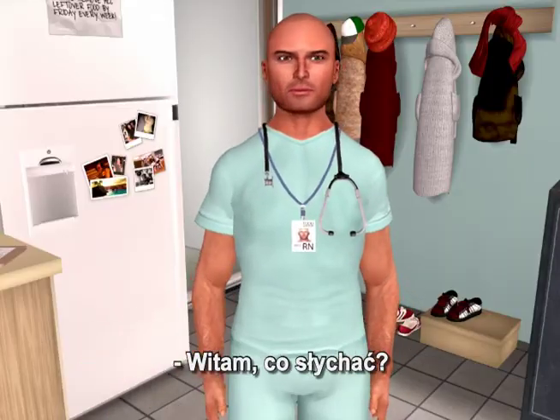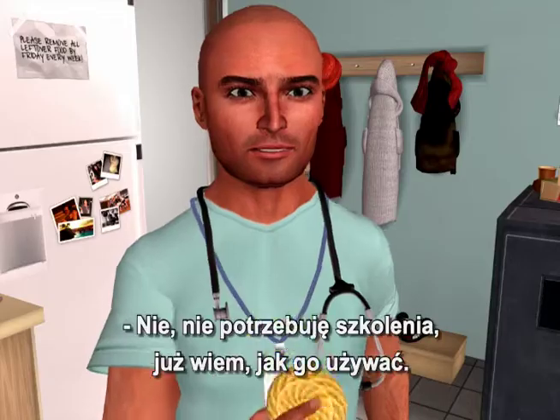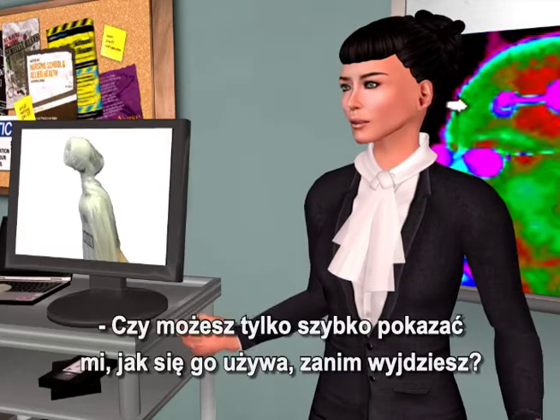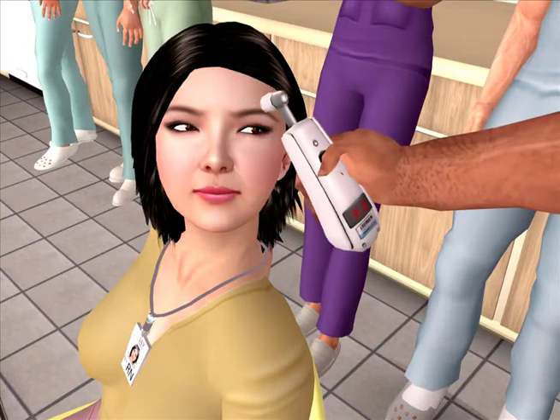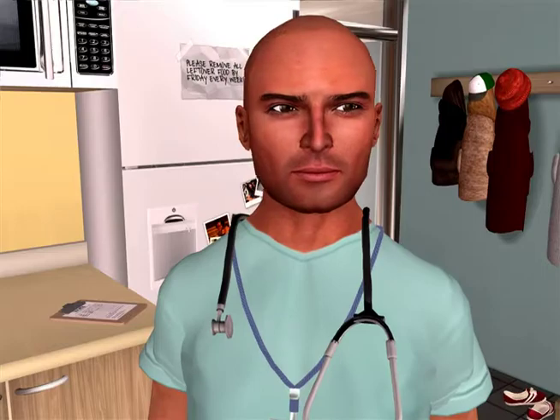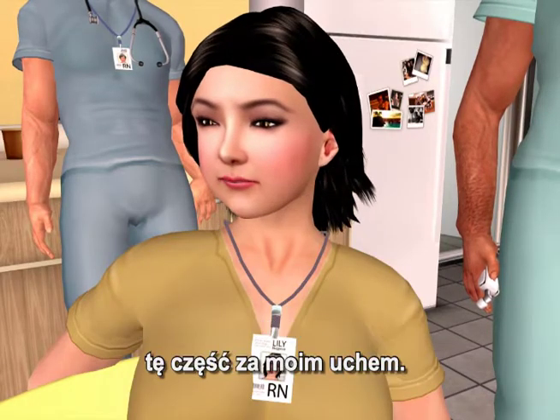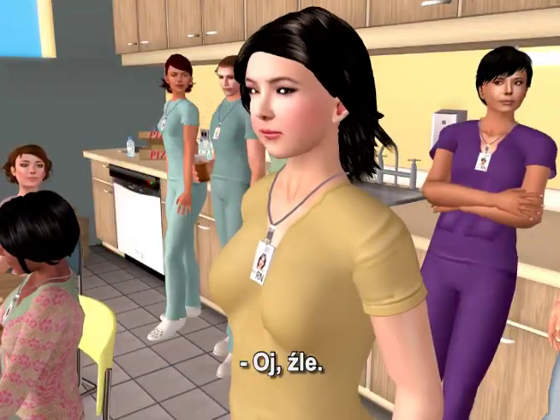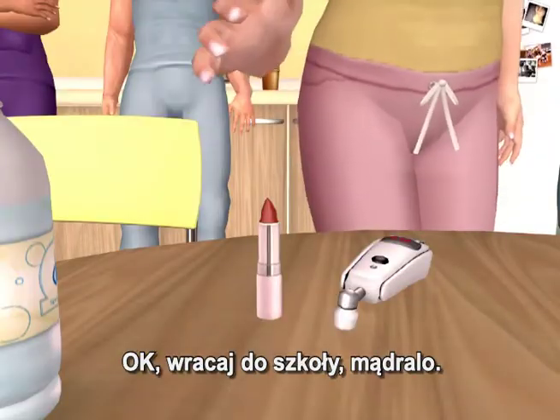Hey, what's up? Hi, we're having an in-service for the temporal scanner thermometer. Will you join us? No, don't need to. I already know how to use it. Would you just quickly demonstrate for me before you leave? See? Well, you got it half right. The part behind my ear — wait a minute, it's right here, by the way. Wrong. Okay, back to school, Smarty.